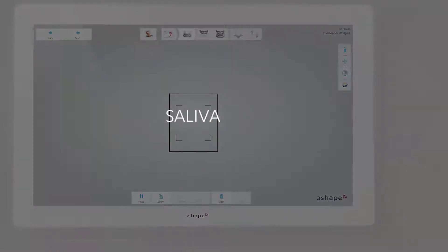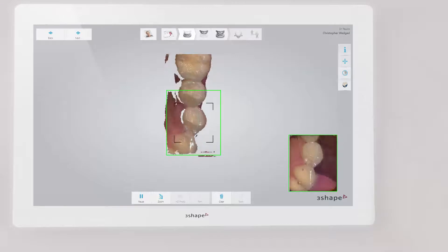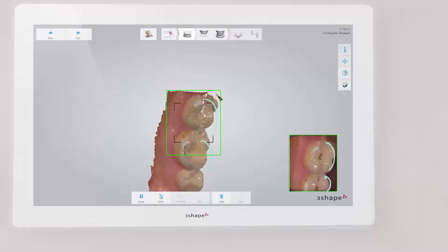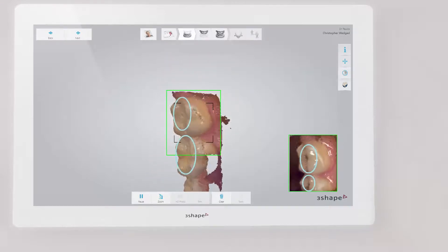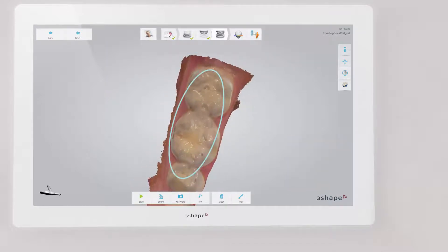Finally, avoid bubbles of saliva being scanned onto the occlusal surface. Dry the teeth before scanning. Check the 2D live stream to see if there are a lot of white spots. Thick saliva and air bubbles will result in incorrect scanning of the molar surface.